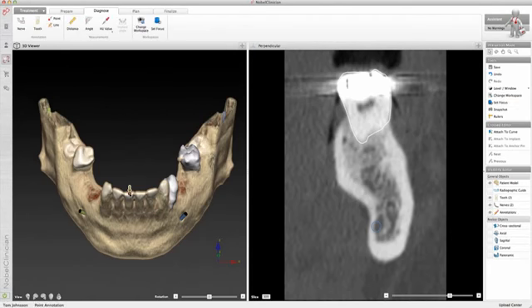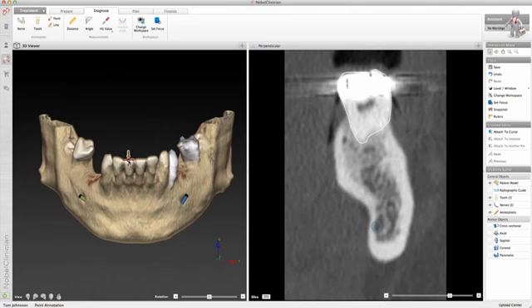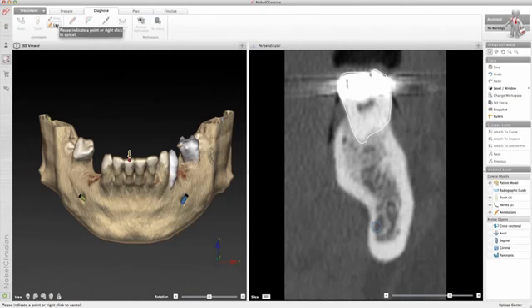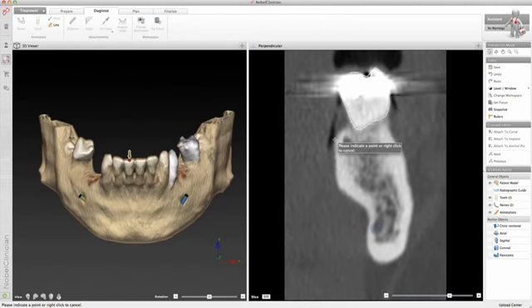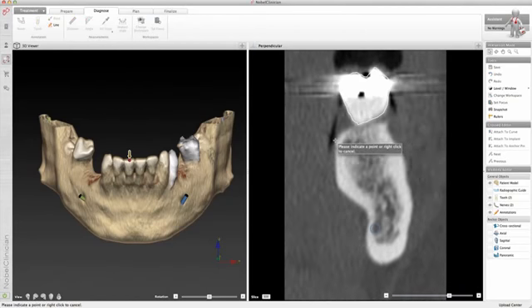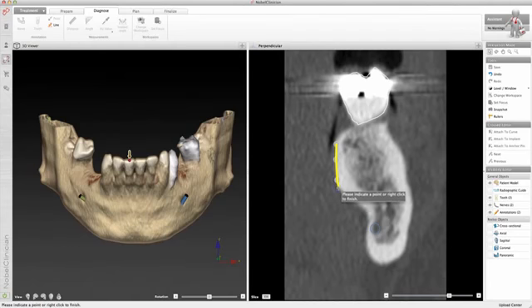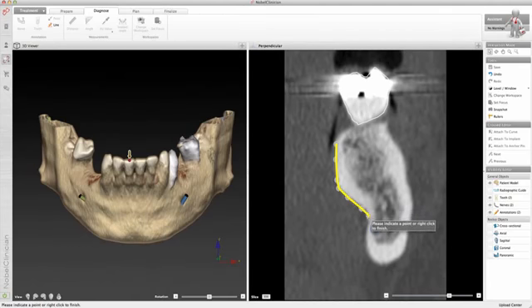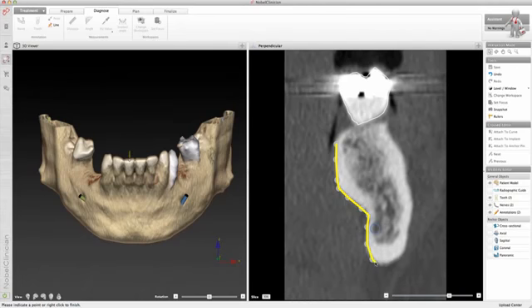This point can be adjusted by clicking and moving the point. Or you can delineate important anatomical structures using the line tool. Mark out points and right-click to finish. The line can be adjusted by clicking and moving the points.